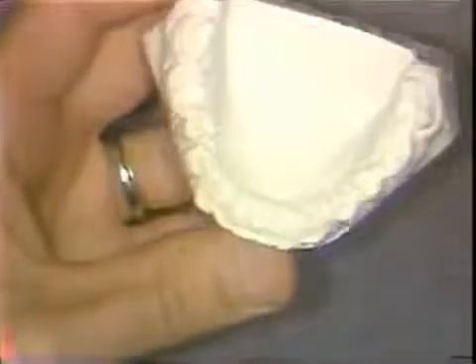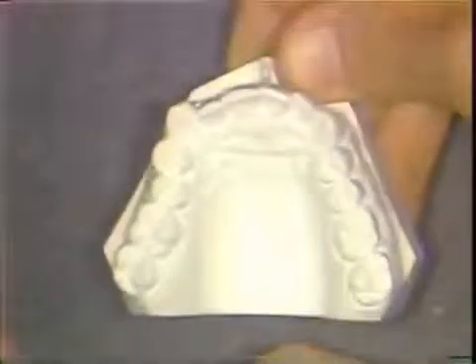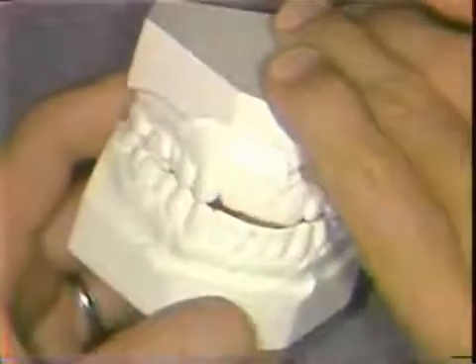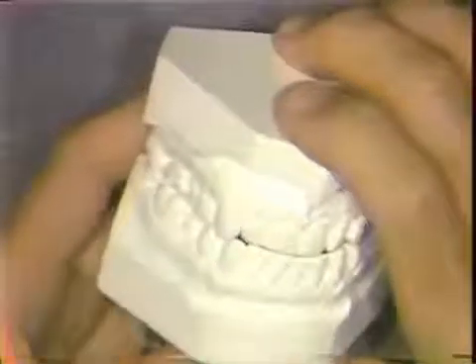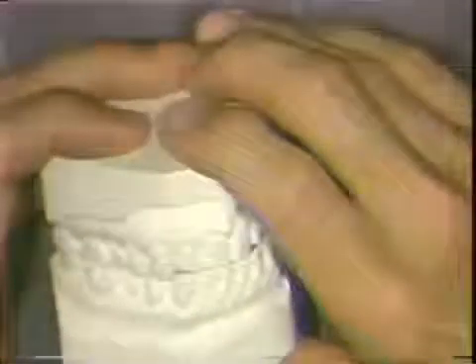This is a clinical picture seen very often in lower arches where the first or second molars have been expanded and the upper molars are contracted. The placement of a lingual arch in conjunction with appliances cemented to all the teeth will work out favorably for this type of problem.